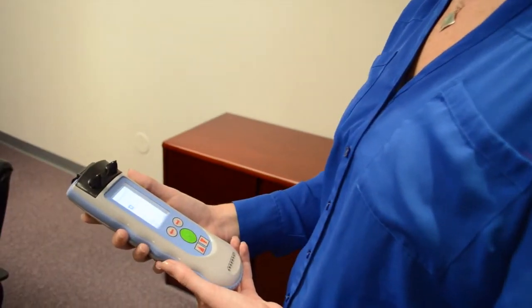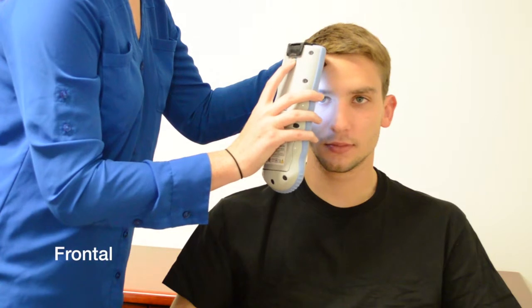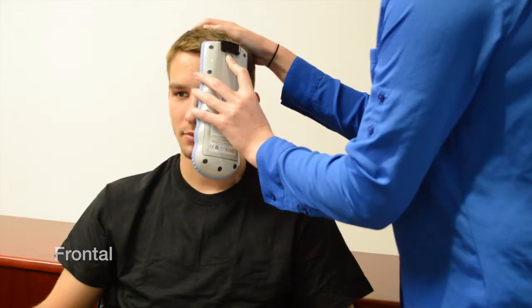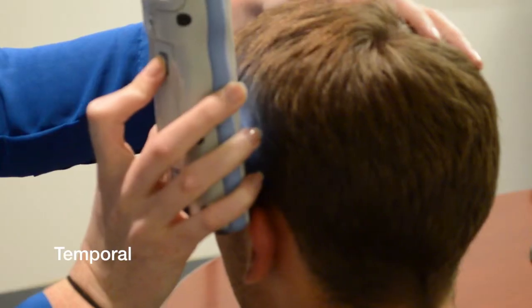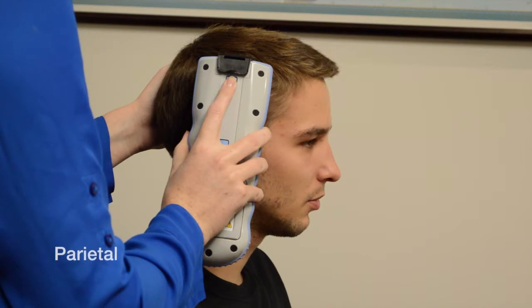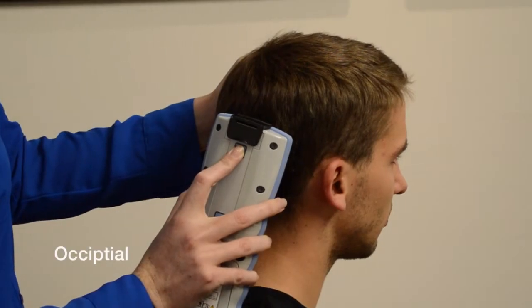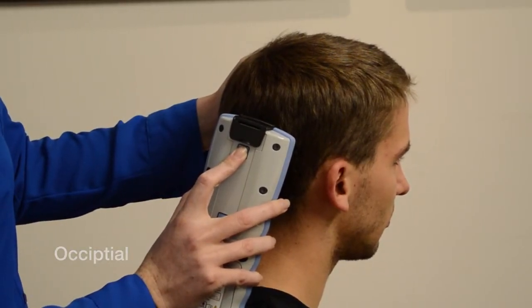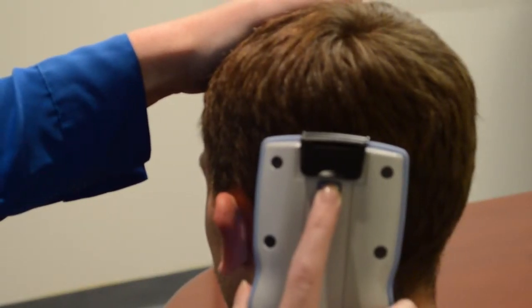Let's review the measurement points. The frontal measurement is above the pupil just under the hairline, with the center probe lining up with the pupil. The temporal measurement is in the temporal fossa in front of the top of the ear. The parietal measurement is above the ear, midline between the ear and midline of the skull. The occipital measurement is on the back of the head, midway between the top of the ear and occipital protuberance, two to three centimeters above the top of the ear.